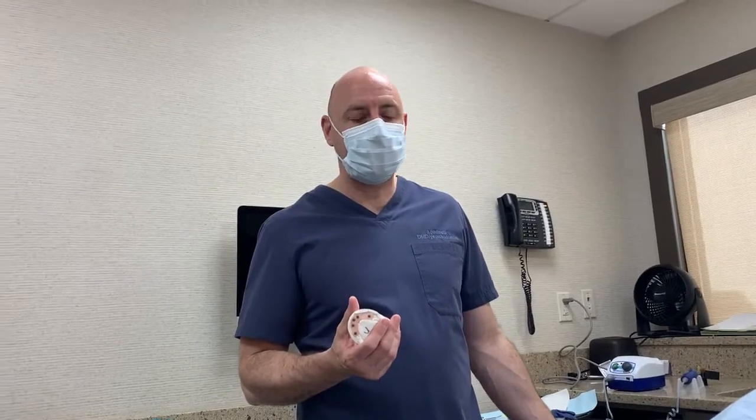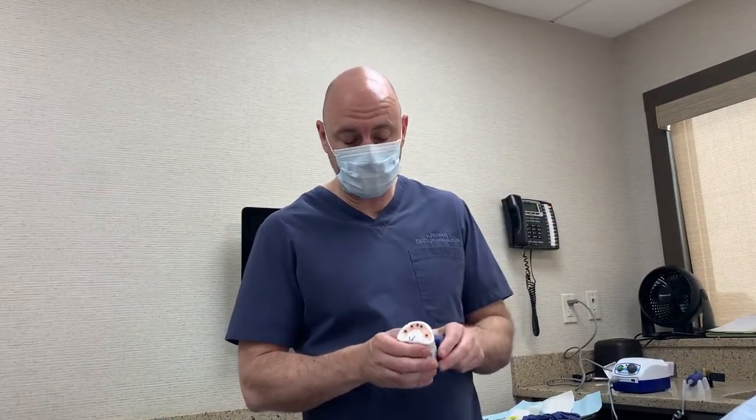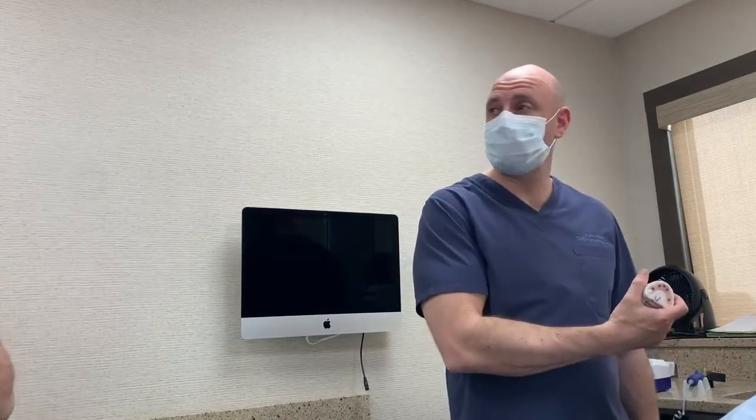It is passive. It's called passive fit, where when I'm screwing it in, all screws are engaging and I'm not getting resistance, because if it didn't fit, you would get some resistance. Also, we did our cast confirmation, and if you really want to check that everything is accurate, this cast that we made our final impression with will fit on the temporary. The temporary will screw right on here passively. So I don't need to radiograph to see if everything's seated. You might want to radiograph to see if your multi-unit abutments are seated, because they might not be seated and I'm making it too ill-fitting. But whatever. That's that.